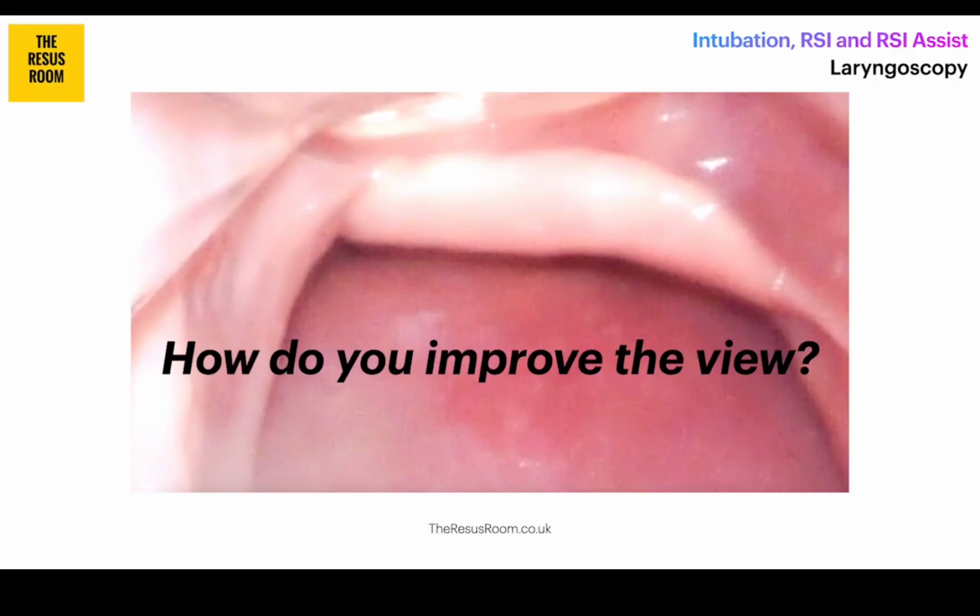Now, you mentioned earlier about improving the view during laryngeal exposure with that head lift and external laryngeal manipulation. Can you talk a little bit more about those? So go into a little bit more depth for me, Langers.